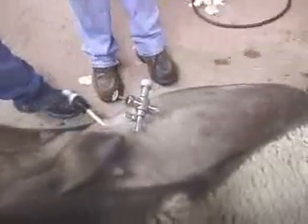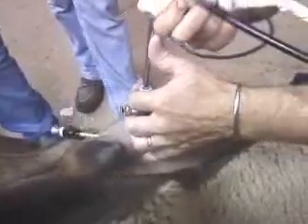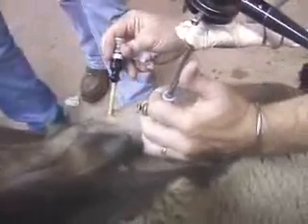The first trocar is used to house the laparoscope. The second is used to manipulate the uterus and uterine horns in place for insemination. The laparoscope is then pushed through the first trocar, while the second trocar is used to manipulate the uterine horns into position for insemination.